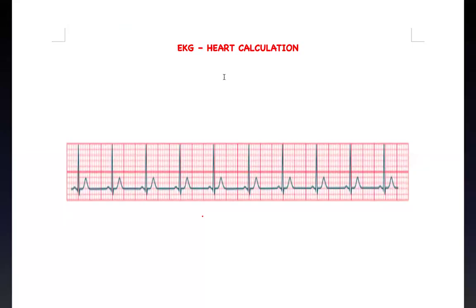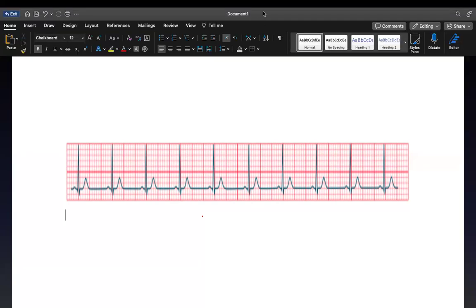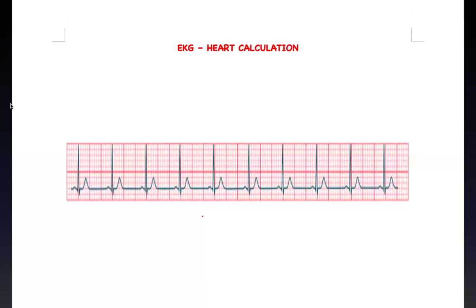Welcome to Adapt NCLEX. If you're struggling to calculate heart rate on the EKG strip, stick around. This is a simple, straightforward video to help you master the calculation if you're in nursing school or you're planning to take your NCLEX. First, you have to know key facts, right?